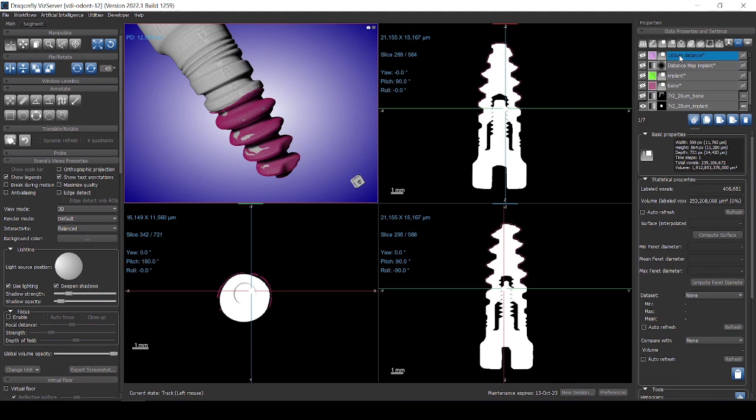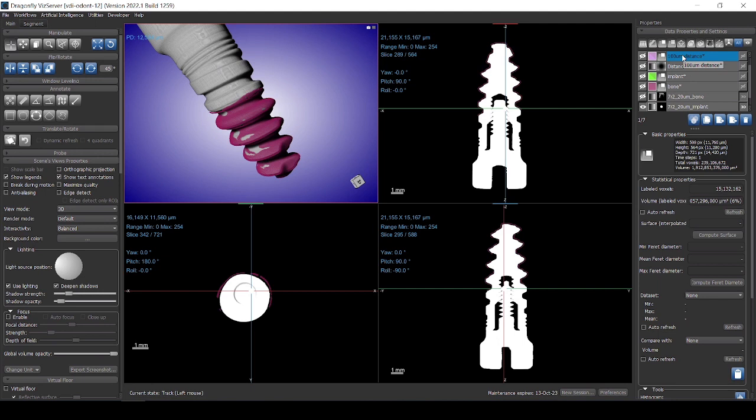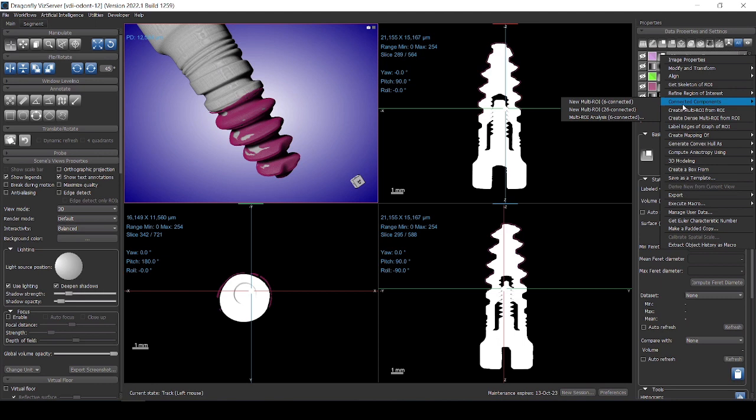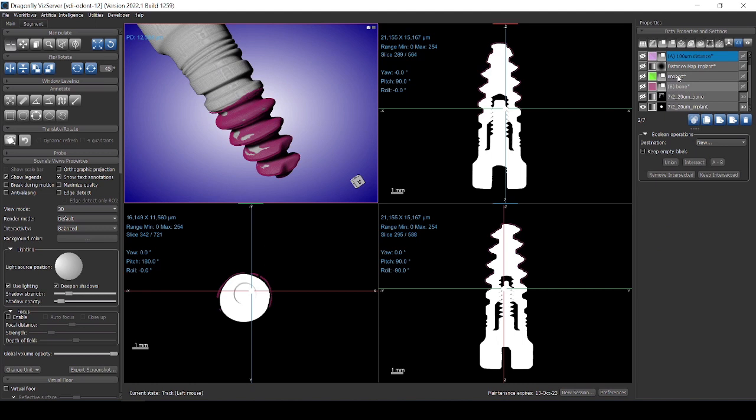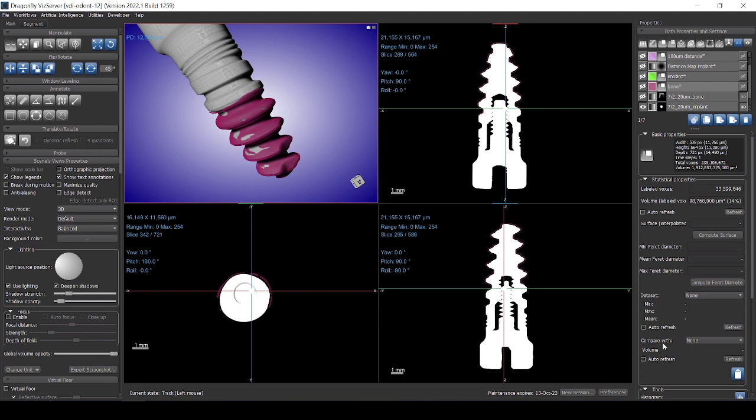So that is basically it. But we can also do analysis on that. So if you want to measure how much volume of bone was grown here, you can right click and you can just calculate the volume by doing this basically here. If you click here, you'll see the volume updated here. You can have the volume in relation to the size of the implant or to the amount of bone. If you calculate the volume for both of them, since it's already calculated actually, you can just compare with. And then when you choose the other one, you're going to get a percentage of one compared to the other. Sorry, this video was basically improvised. I'm just doing as I talk to you. So I hope it helps somehow.